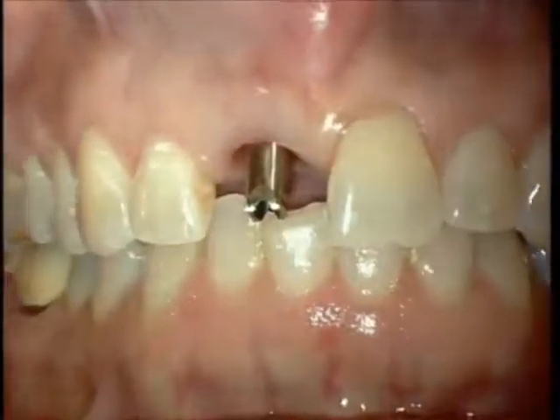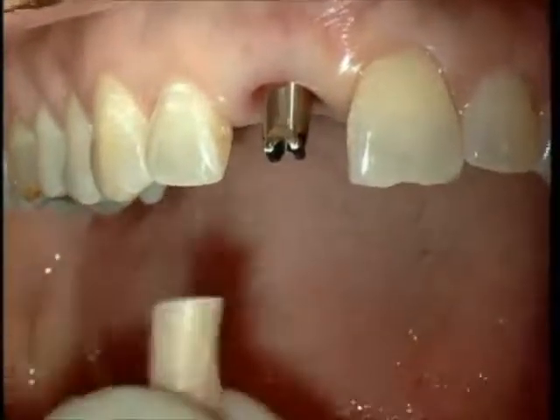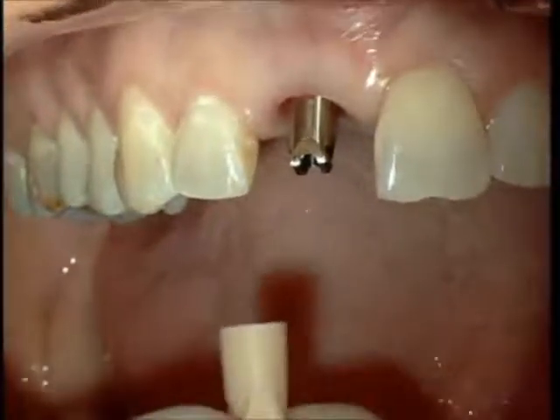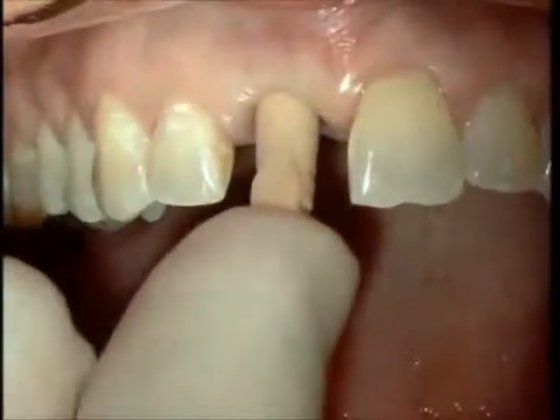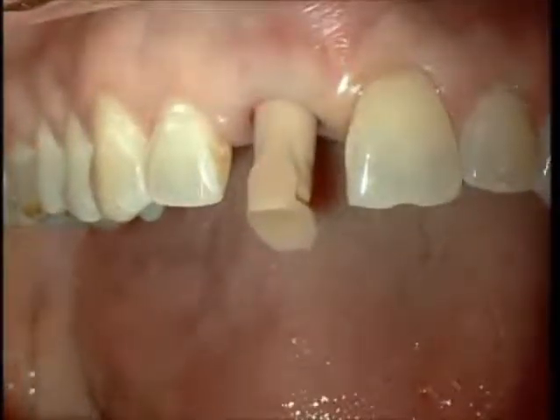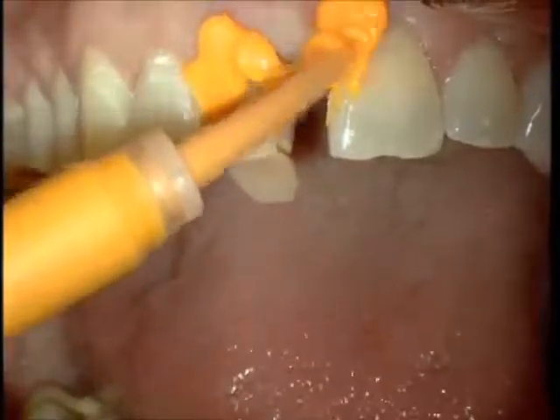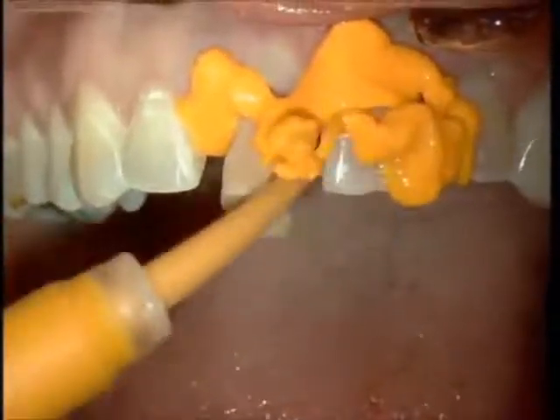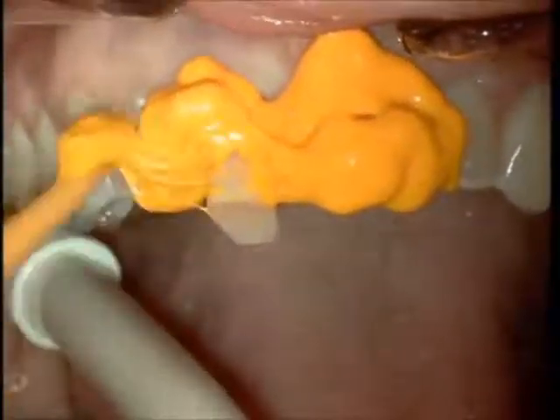One of the nice attributes of this HLA contour, anatomic contour abutment, is we can put it in once we decide on the depth of the margin. We can then snap in. This is something that the restorative dentist can do, or the surgeon, because it is rather easy. And this is what your restorative dentist would be able to do, is just basically take their impression of the soft and hard tissues and pick up this impression cap and send it off to the lab for them to pour it up with the analog.